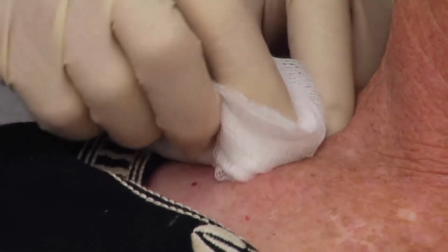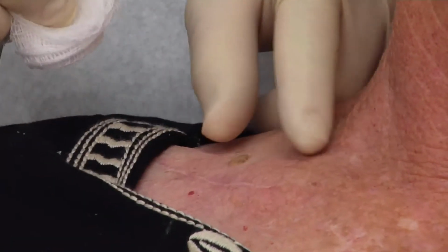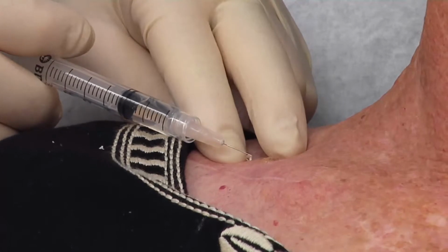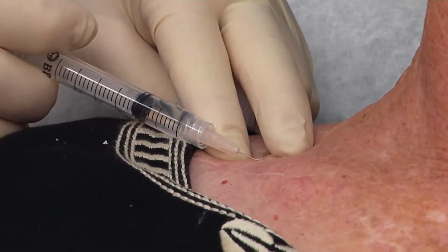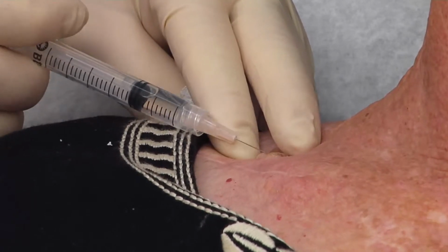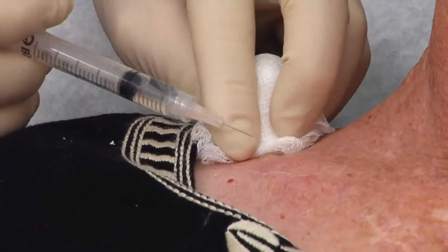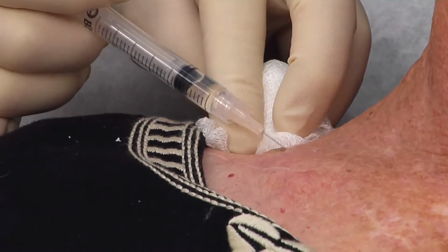I'm going to biopsy this irritated seborrheic keratosis here. It's in a bad location on the clavicular skin, irritated by seat belts and clothes. I'm going to numb it with a shot of xylocaine with epinephrine, which has been buffered. So the onset of anesthesia is instant, and we'll use very little drug by injecting just around the edges, using a high intradermal technique to create a small wheal.